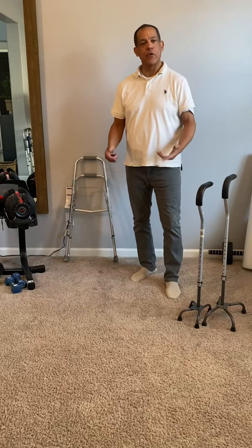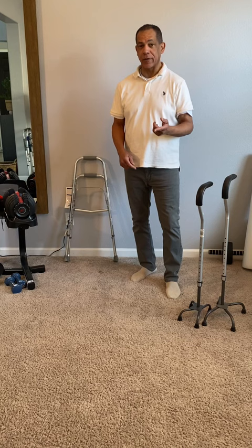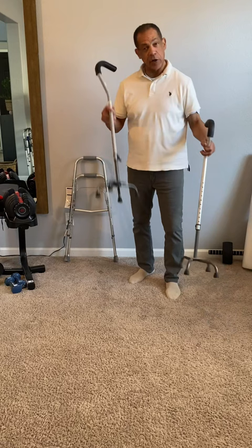So what could you use to help you get around a little bit better if you're having trouble walking, but you can only use one arm? Most people are familiar with the quad canes. You have a narrow-based quad cane and a wide-based quad cane.